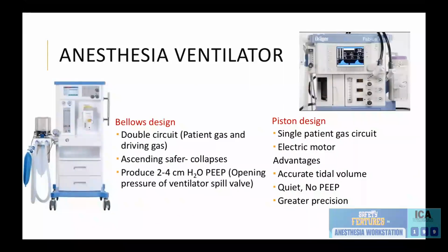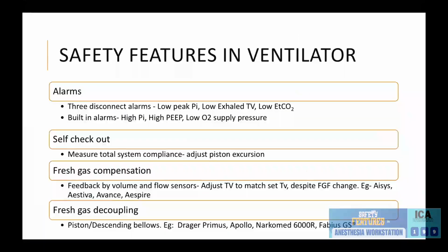Then the piston design ventilators are electrically driven. They have a single patient gas circuit. The advantage is that they give very accurate tidal volume. They are quiet, they have greater precision, and the PEEP which is required to open the pressure of the ventilator spill valve in bellows design is not present here. So no auto PEEP is generated. So understand which kind of ventilator you have.